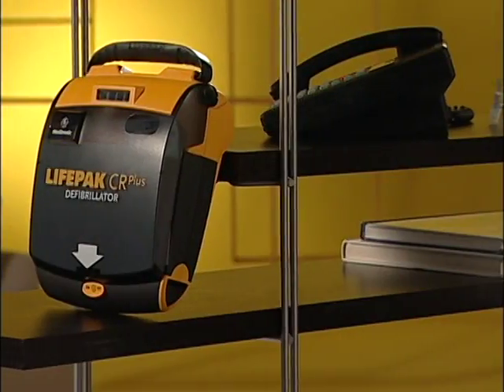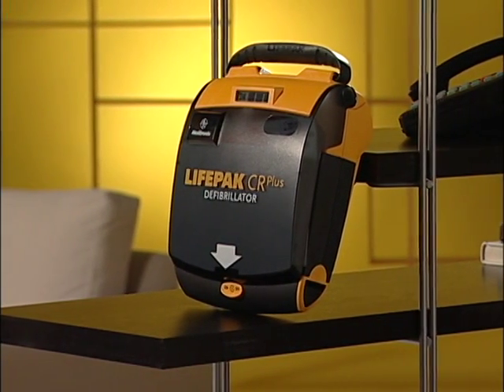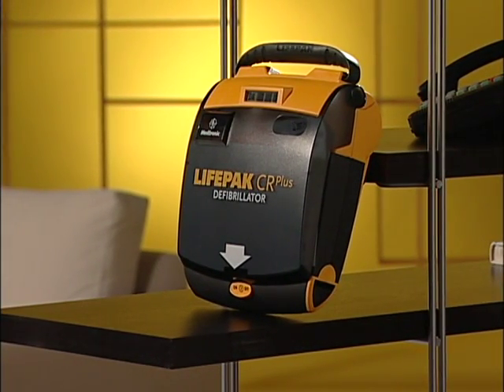And finally, where to store the LifePAK AED. You should keep it in a central location, preferably near a phone so you can call 911 while you're getting the AED. Put it someplace where it's easy to see and easy to grab in an emergency. Make sure everyone knows where it is, and if you take it out, be sure to put it back in the same place. So there you are.